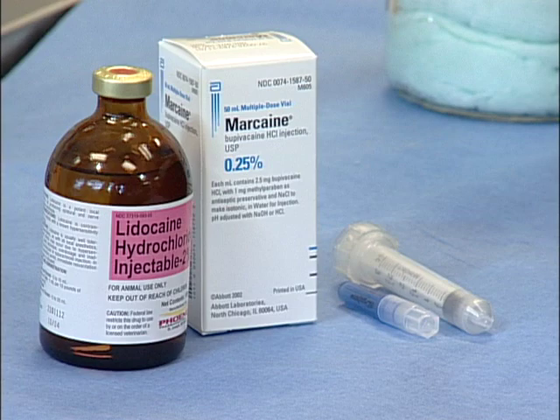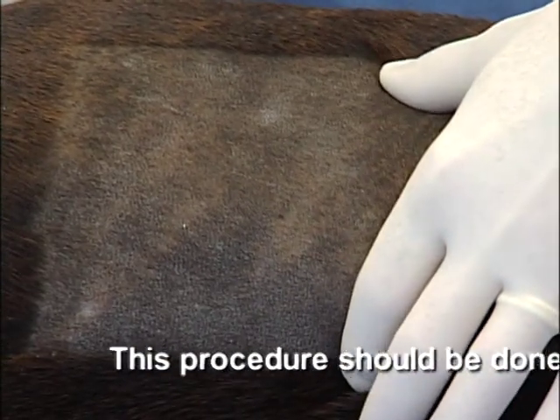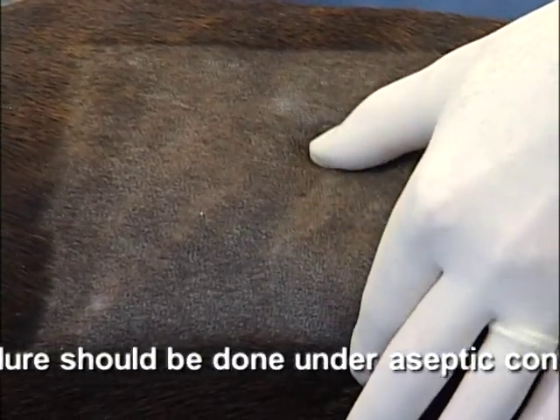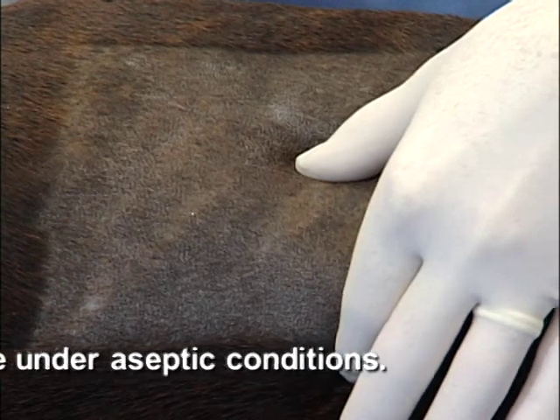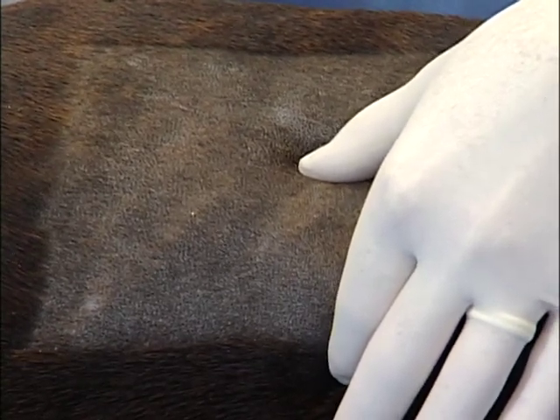We're going to palpate the landmarks at the site, feel the dorsal spinous processes of the dog's spine, feel the lumbar musculature, and push through the musculature to the caudal and most dorsal aspect of each of the ribs.